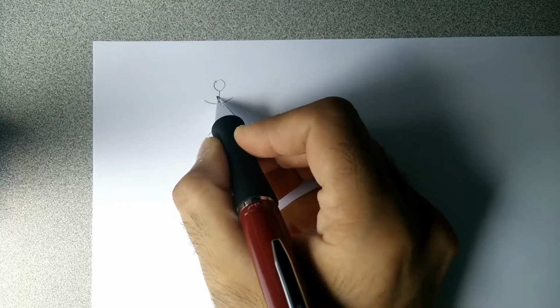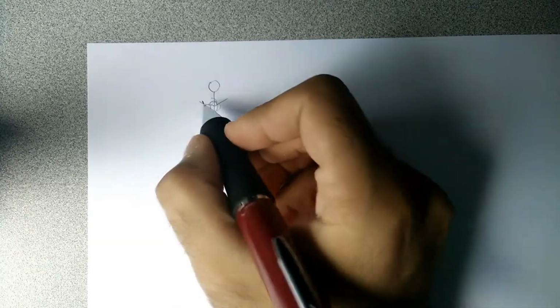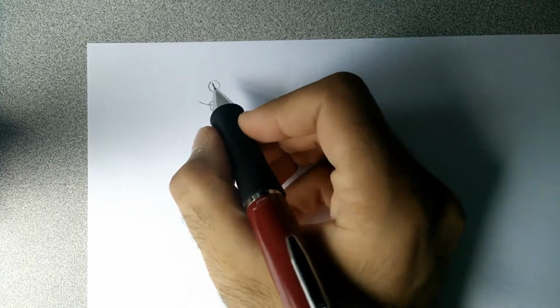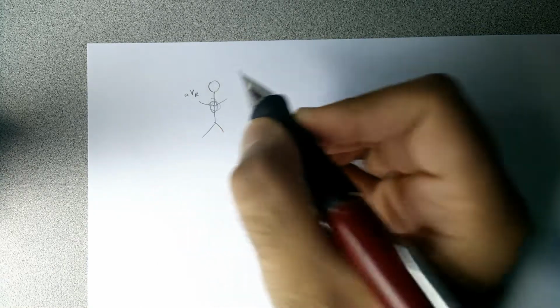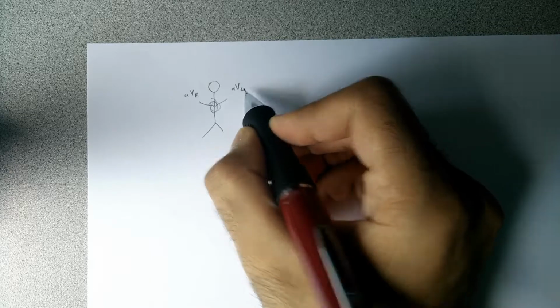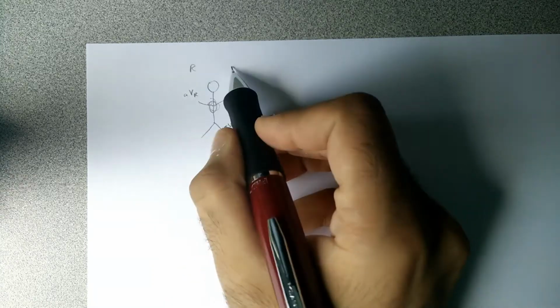and the heart sits right here, in the middle of the stick figure, and we're going to have a few leads that we're going to place. There's a lead called AVR, a lead called AVL, and a lead called AV foot. If we remember, this is the right side of the body, and this is the left side of the body.